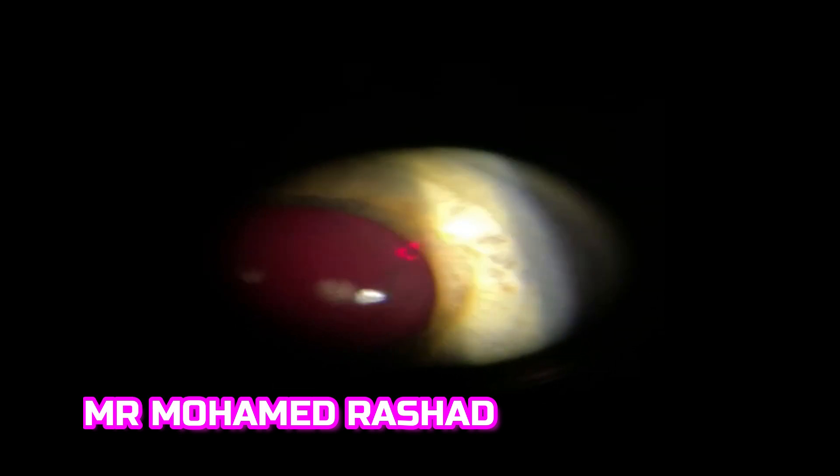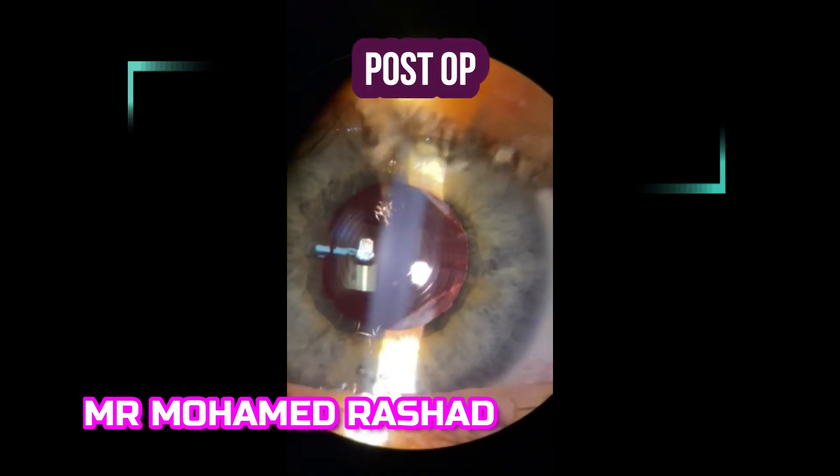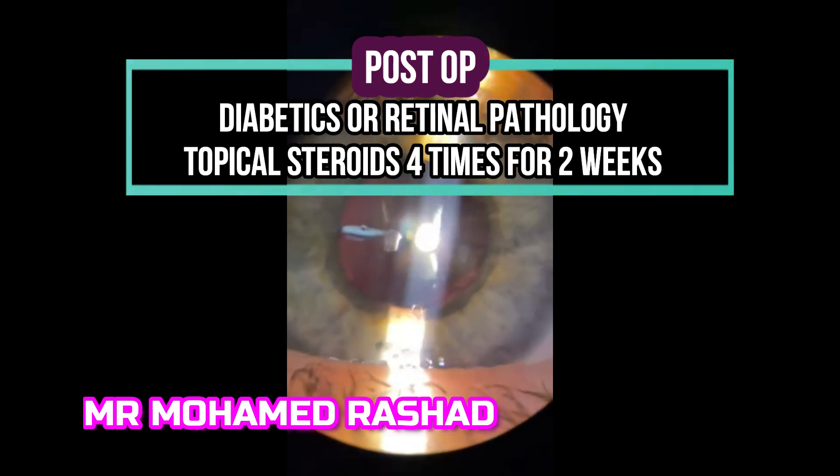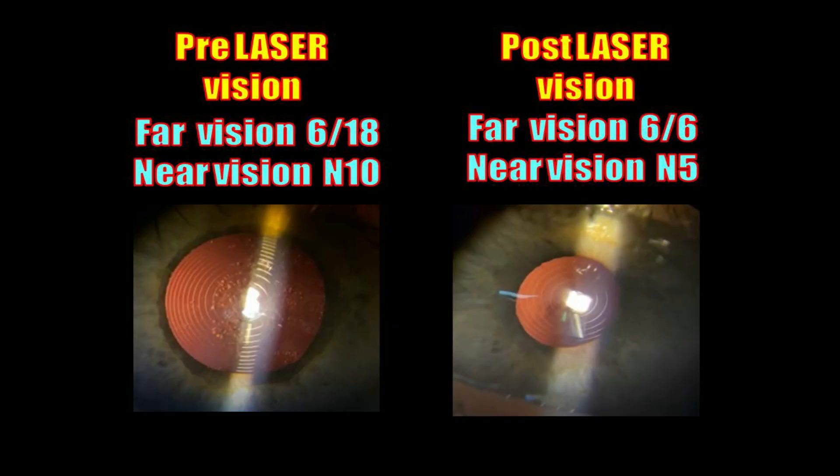After finishing this side, you will have the wide diamond-shaped opening — this is what we aim for. There is still a small part remaining on this side. Post-operatively, you can give steroid drops four times daily for two weeks, especially in diabetics and patients with retinal pathology. Now the patient is happy — distance vision is 6/6 and near vision is N5.